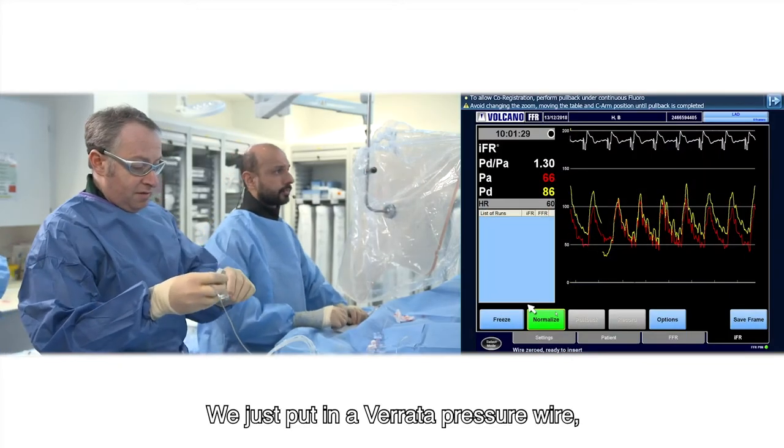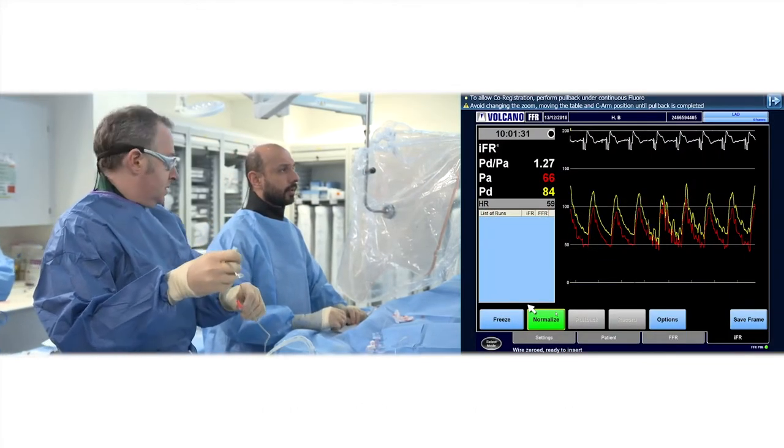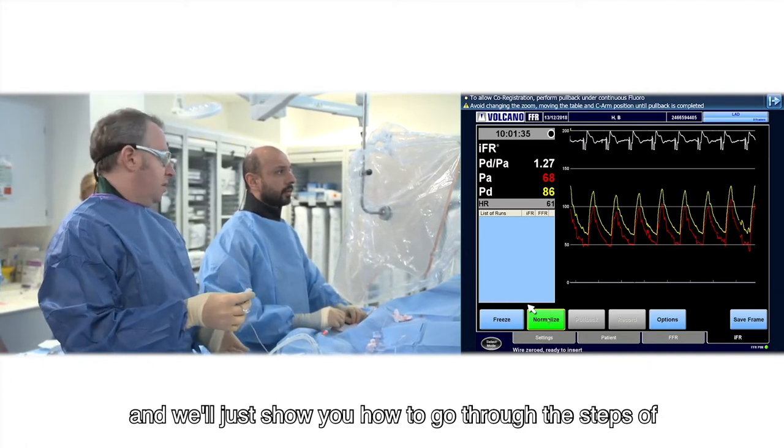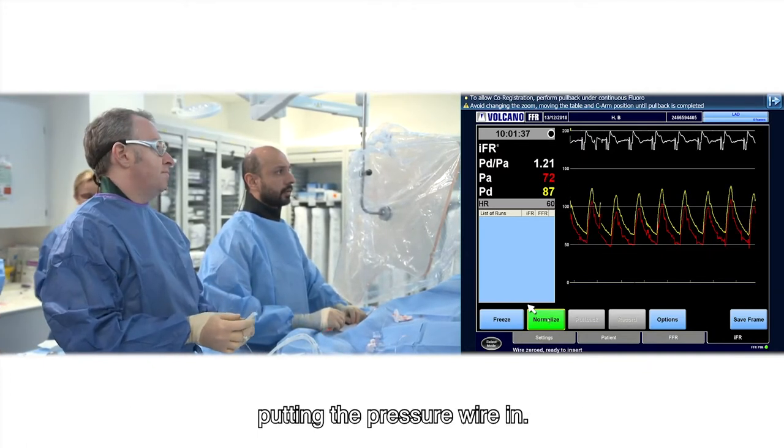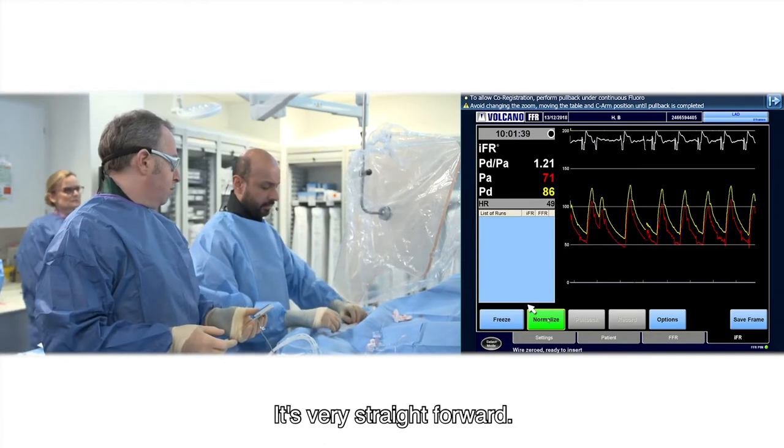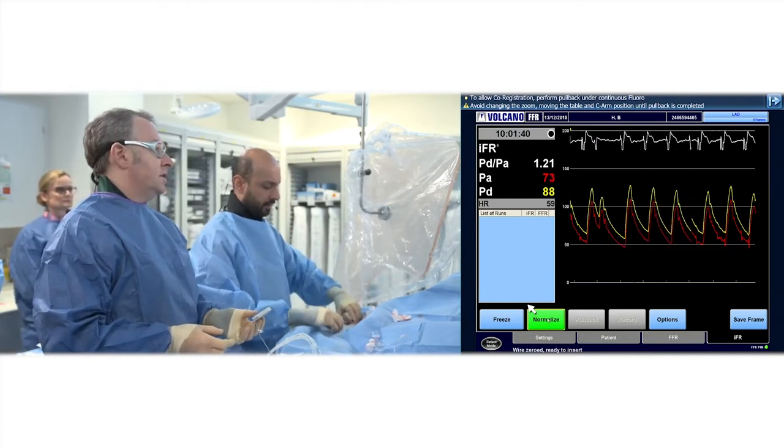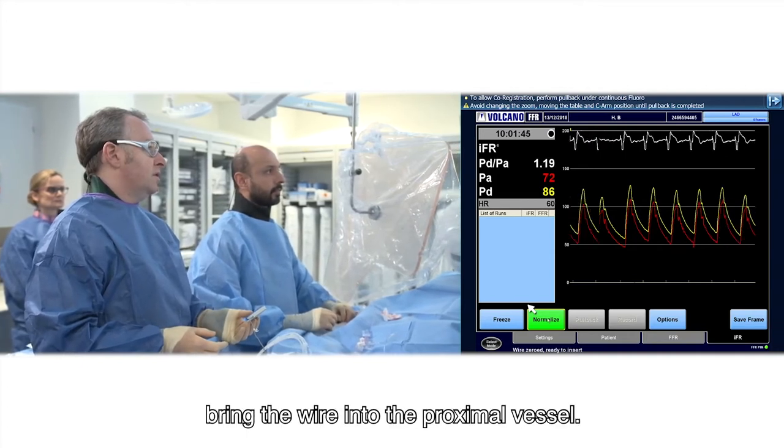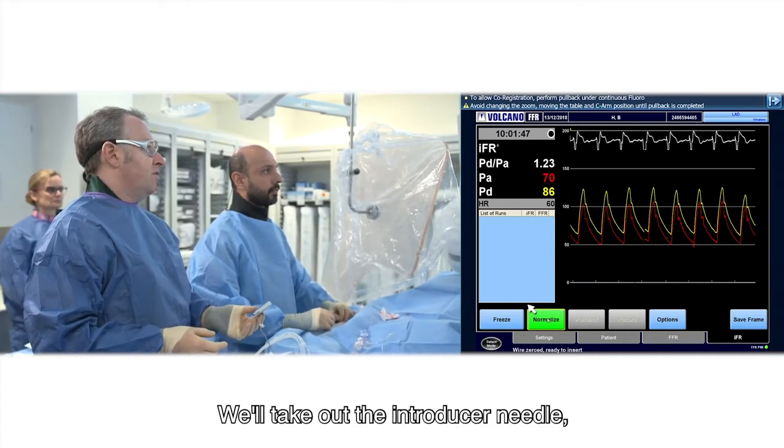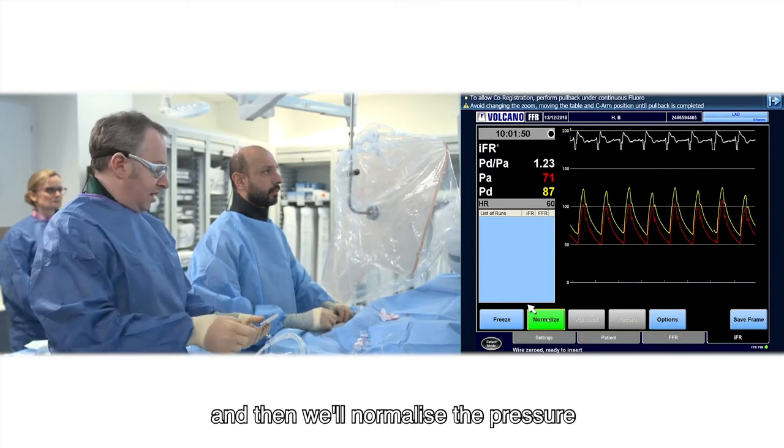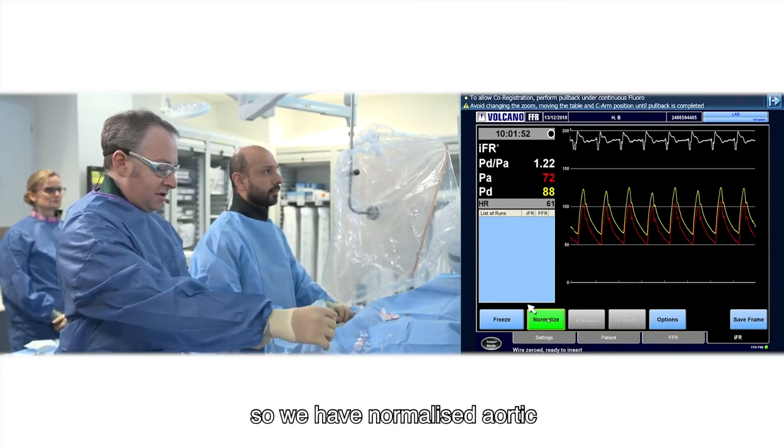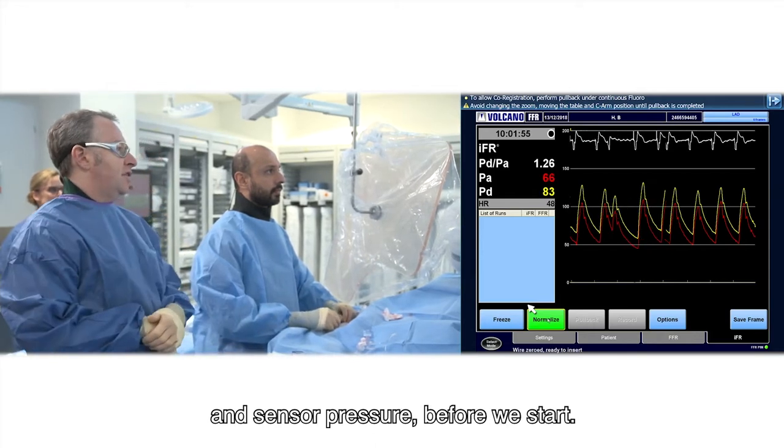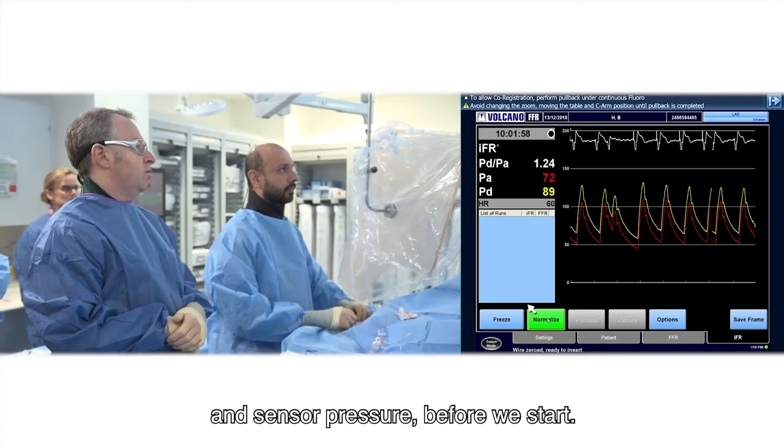We'll just put in a Verrata pressure wire and show you how to go through the steps of putting the pressure wire in. It's very straightforward. So what we'll do is bring the wire into the proximal vessel, take out the introducer needle, and then normalize the pressure so we have normalized aortic and sensor pressure before we start.